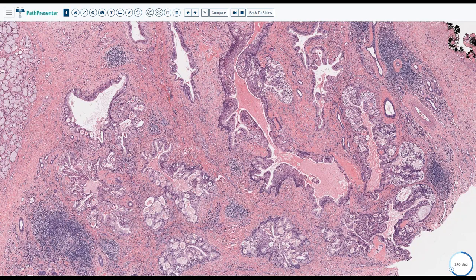Okay, and you have to comment, of course, on the cystic component. Usually you start with fine needle aspiration, and once you see any mucin secreting lesion, you have to alert the surgeons that we are dealing with something that could be mucoepidermoid carcinoma, because it is the most common. So don't just put it into mucocele and that's it. All right, good job. Any question regarding mucoepidermoid carcinoma?